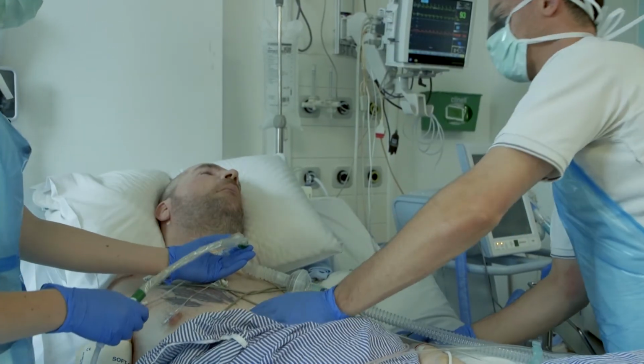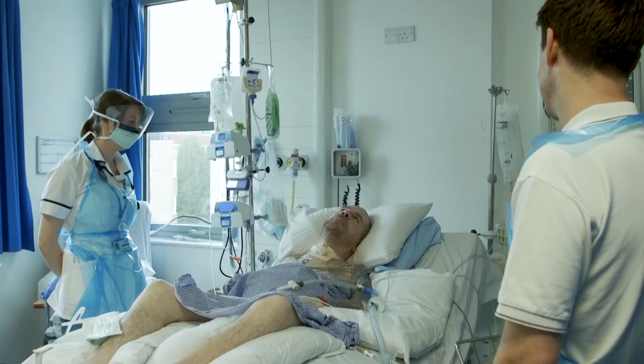attempts to cough. Additionally, the physiotherapists will also decide before starting the treatment what their roles are so that they can communicate with each other effectively during the session. They will also discuss the treatment plan with the patient so they know what to expect during the treatment session.